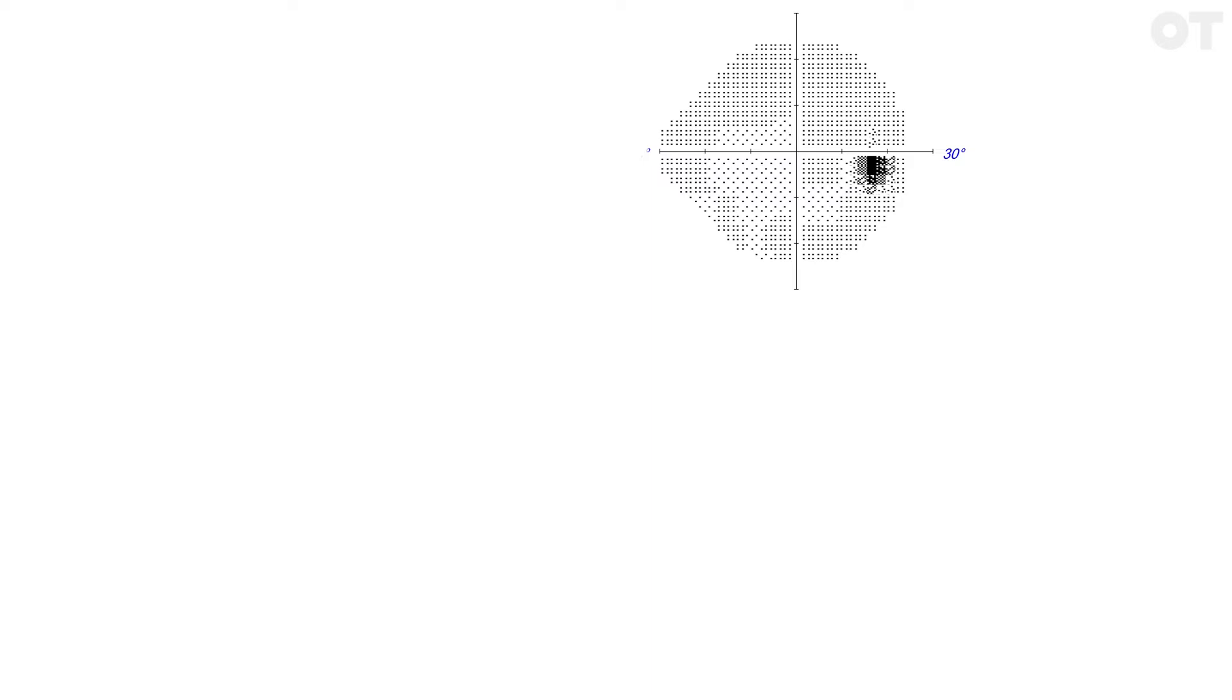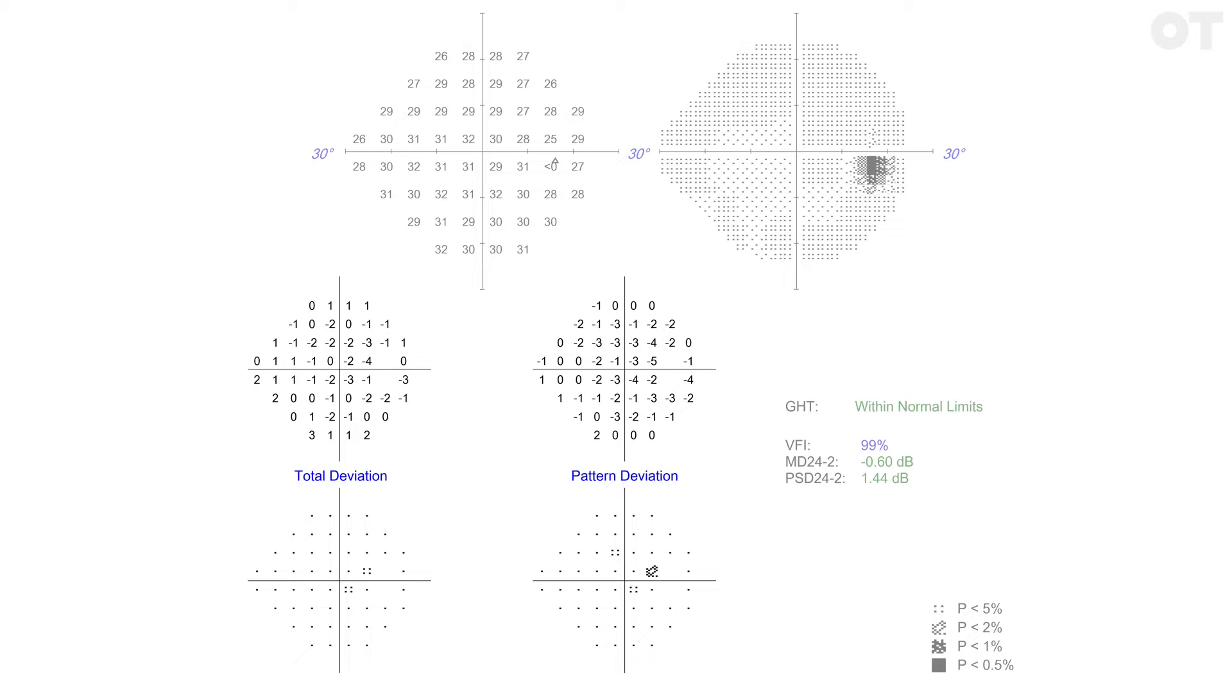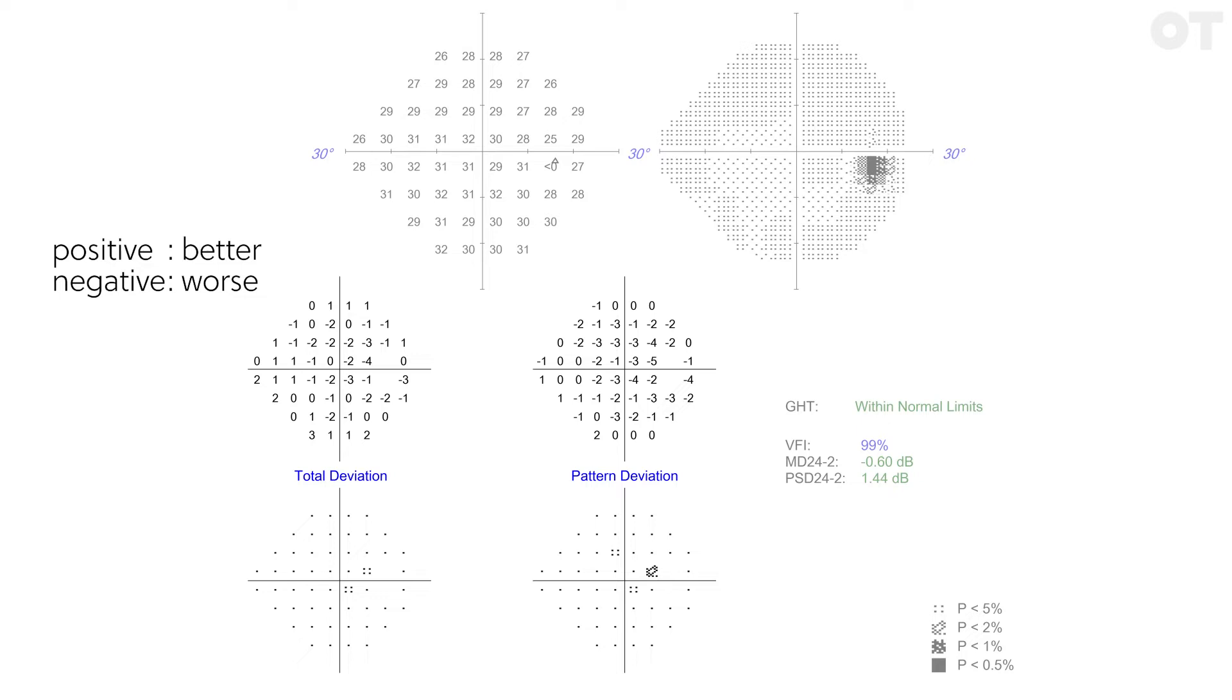Have a look now at the total deviation plots. The numerical total deviation map shows if and by how many decibels each point differs from that of the age-matched normal database. Below this is a total deviation probability map. Here deviations from normal are highlighted when they are statistically significant so normal variability is ignored. A light grey square says that at that location the patient's sensitivity is worse than the bottom 5% of normal subjects of the same age.